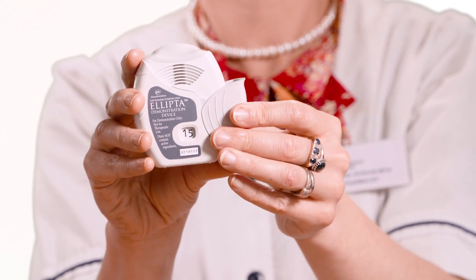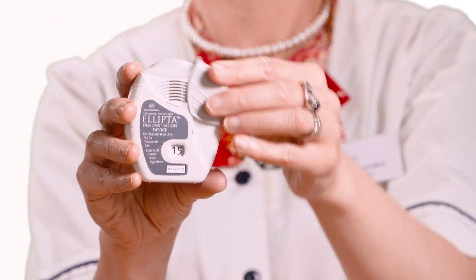Slide the cover upwards as far as it will go to cover the mouthpiece. Remember, especially when using a controller inhaler, to rinse your mouth out with water after use.